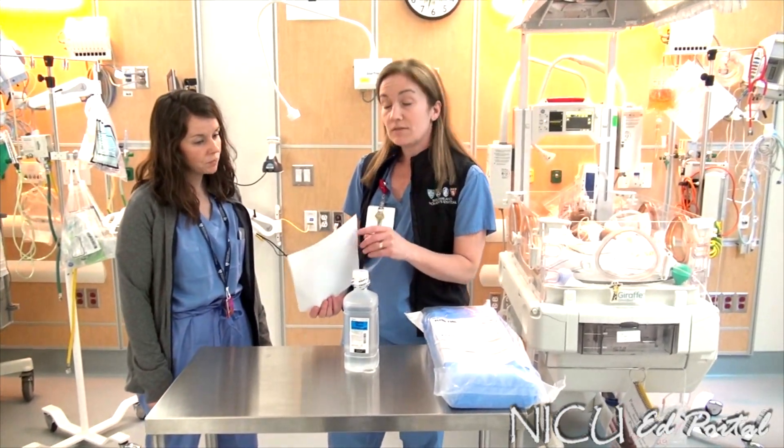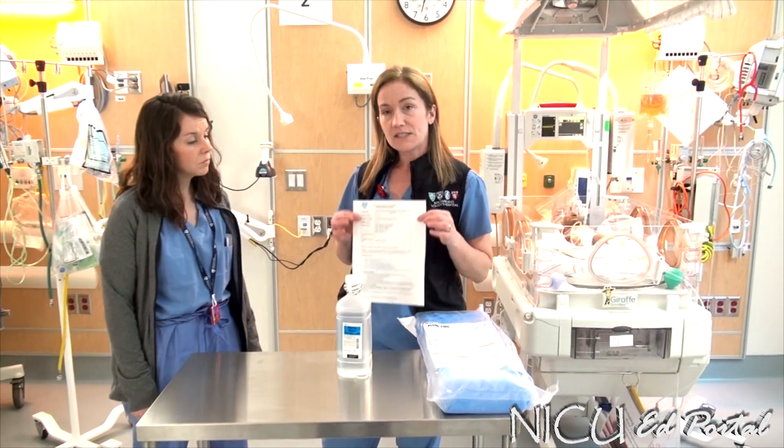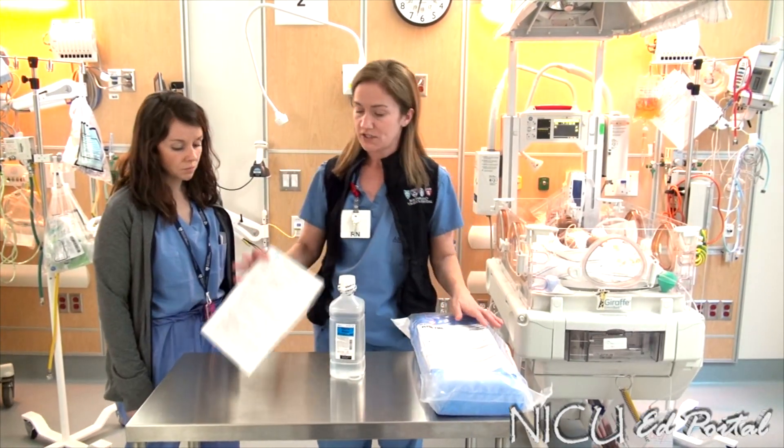Welcome, Joanna. Today we're going to do an in-service training on setting up the Plurvatch Infant Drainage System.